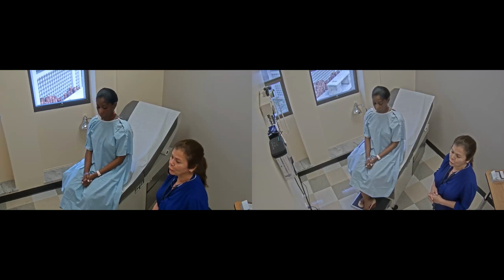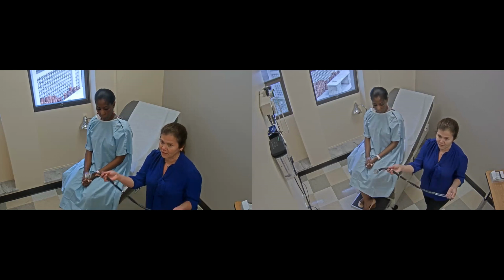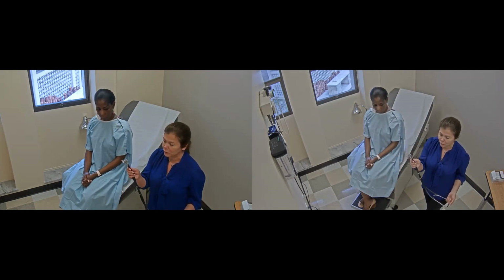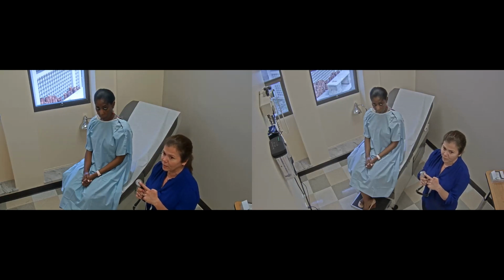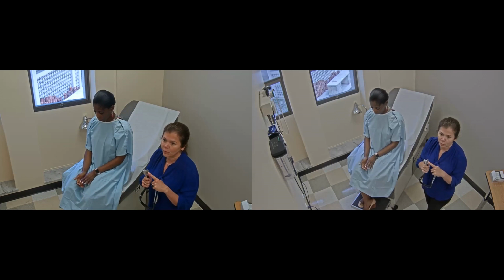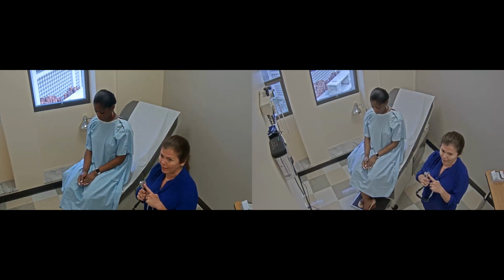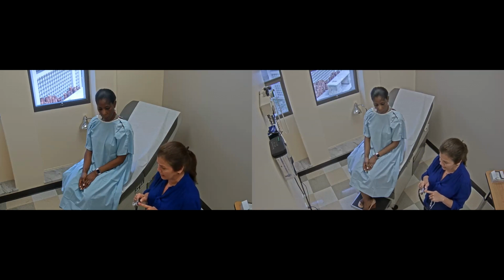So now we're going to do the pulmonary assessment, and for the pulmonary assessment, we're going to be using, of course, the stethoscope. The only part of the stethoscope that will be valuable for pulmonary assessment will be the diaphragm, because any adventitious breath sounds will be high pitched, so they will be heard best with the diaphragm. So the bell is not useful for pulmonary assessment.